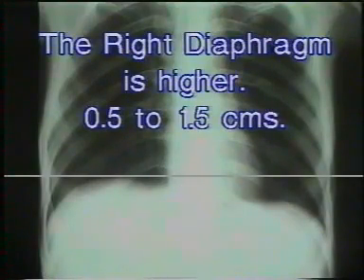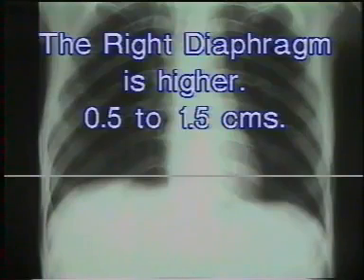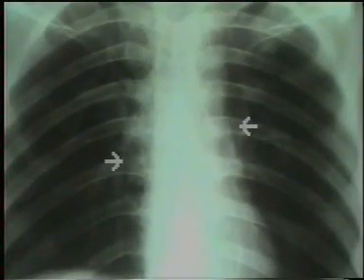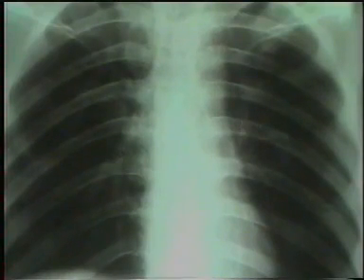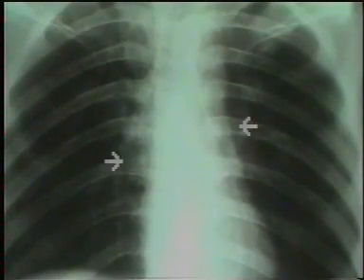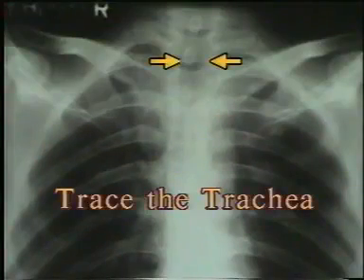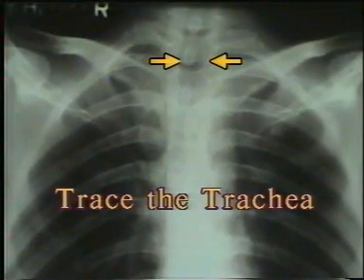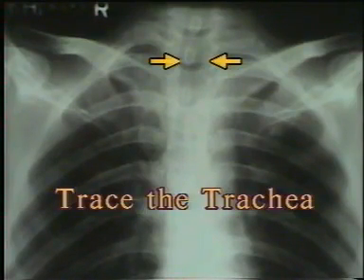The right diaphragm should be 0.5 to 1.5 centimeters higher than the left diaphragm and both should be smoothly curved. Then study the hila, represented by the shadows of the hilar vessels. The left hilum is normally at a slightly higher level than the right. Lastly, identify the course of the trachea up to the carina for any deviation. This completes the inspection of the lung fields.